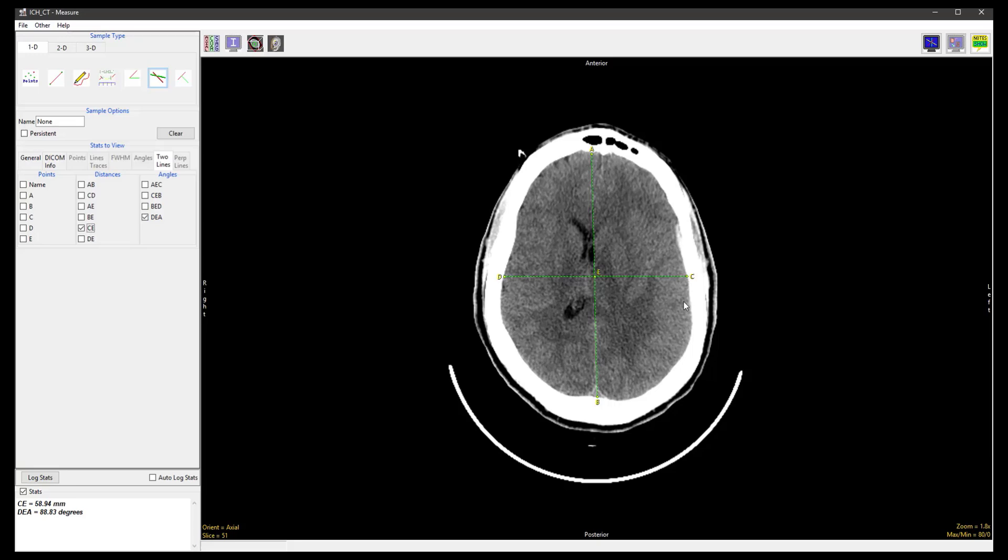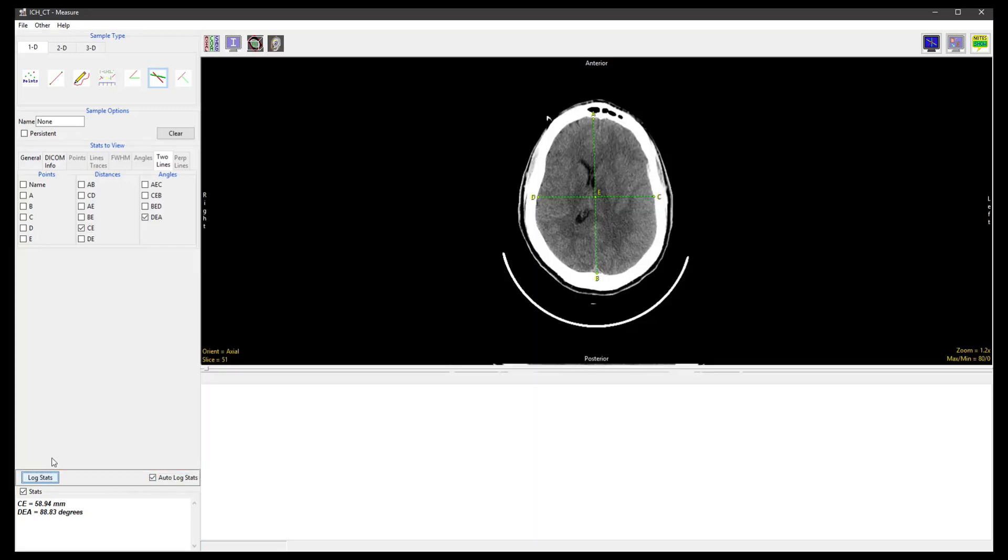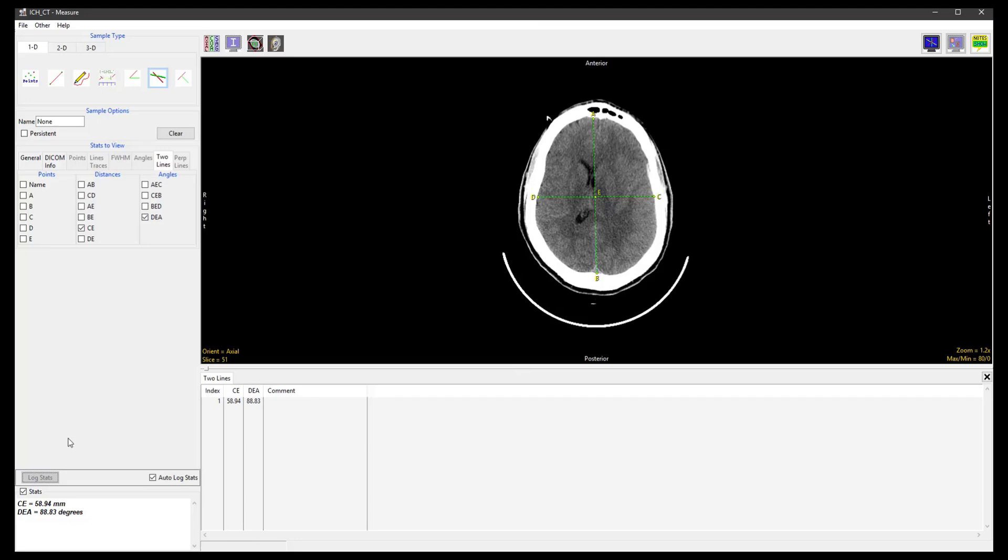The measurements we defined earlier will be shown in the Stats Review panel. Checking the Auto Log Stats checkbox and clicking Log Stats will display these measurements in the Stats Log.